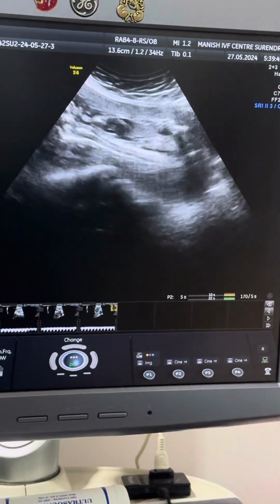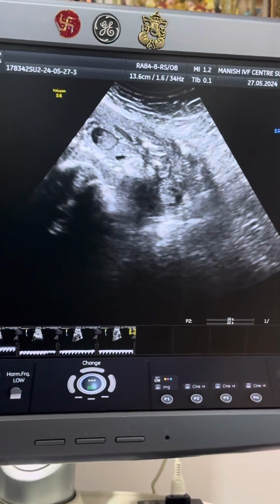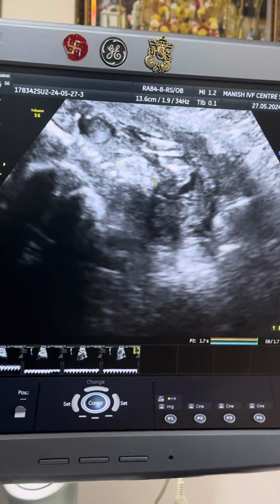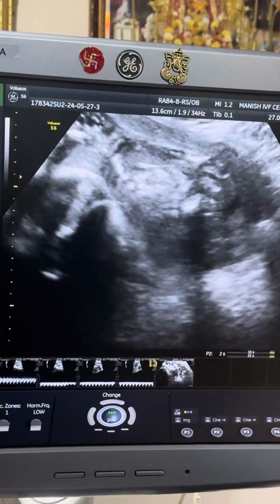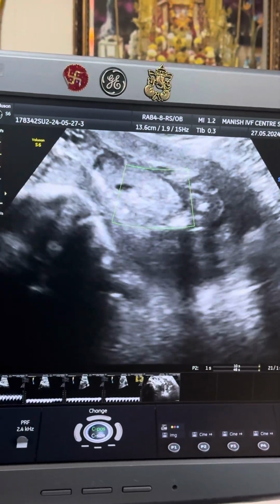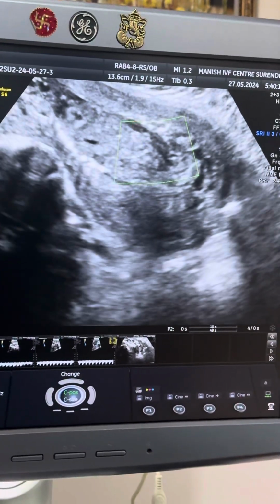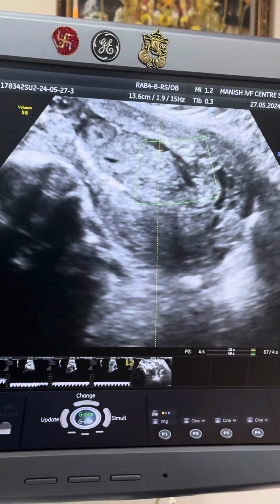Again see the heart anatomy is very well, and the patient has got dysplastic kidney. Here you can see kidney which is dysplastic, white color kidney. Usually kidney we can't see on this ultrasound, but because of dysplastic kidney it looks white, so it doesn't get blood supply that much. Because kidney is not getting enough blood supply, there is severe oligohydramnios and bladder is also not filled one. Here also you can see umbilical artery.